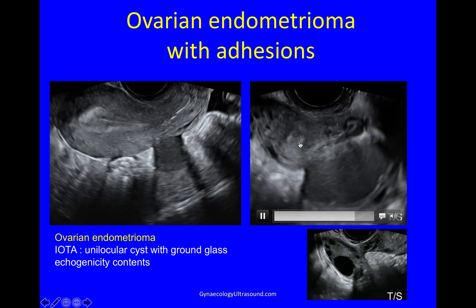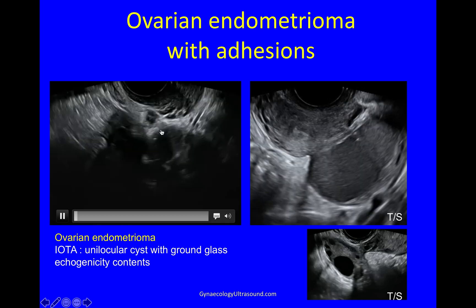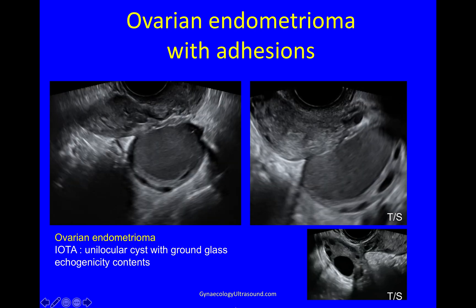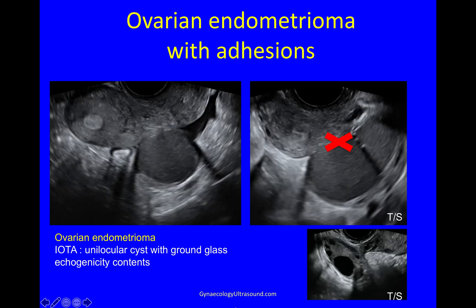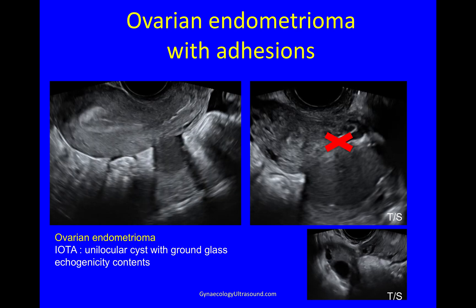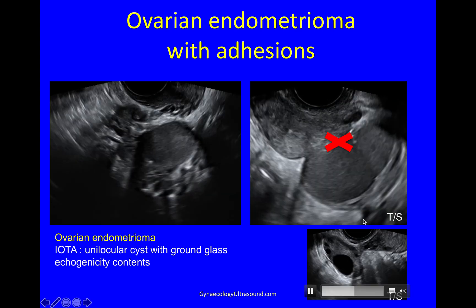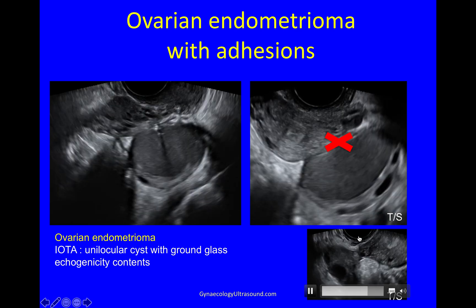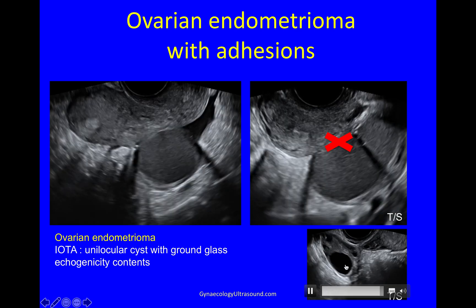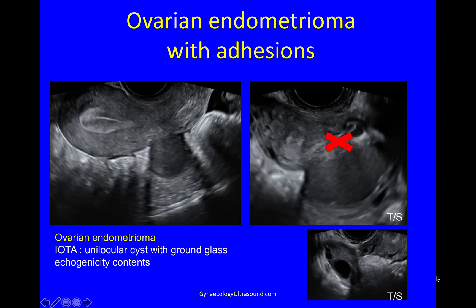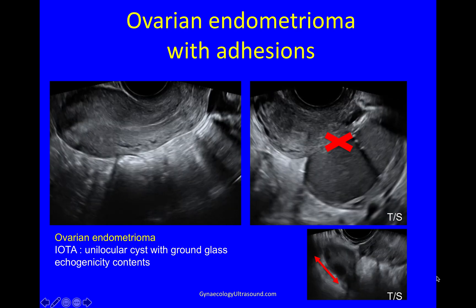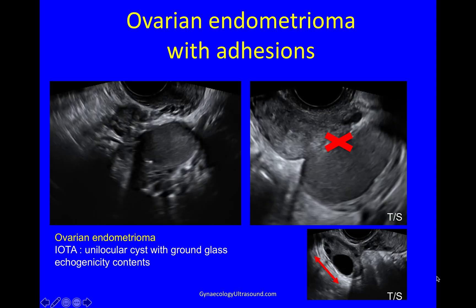This is the level of the internal os just there. And compare that to the other ovary, with which the very gentle pressure of the probe in the vagina is cantilevering — that's a nice mobile ovary.